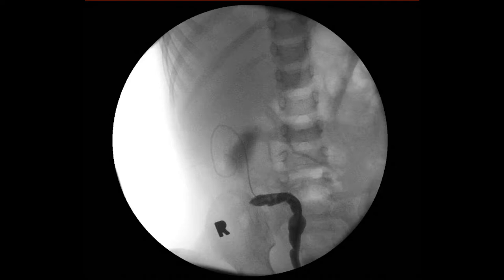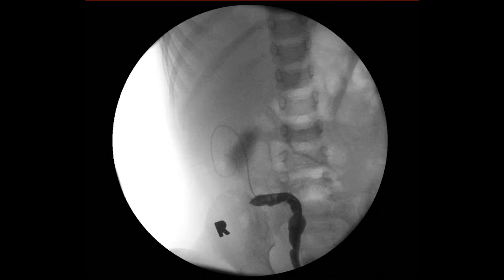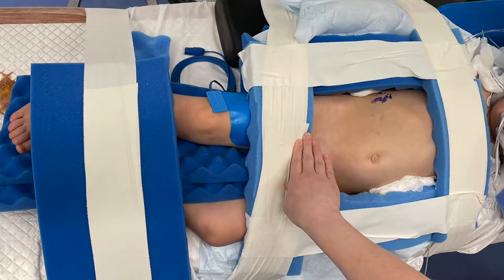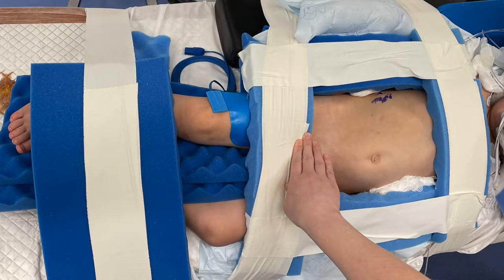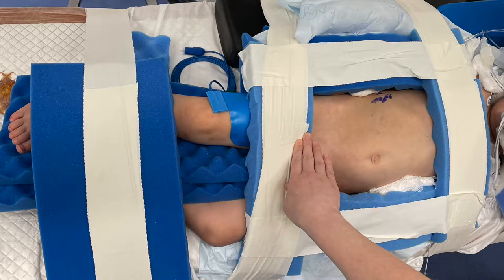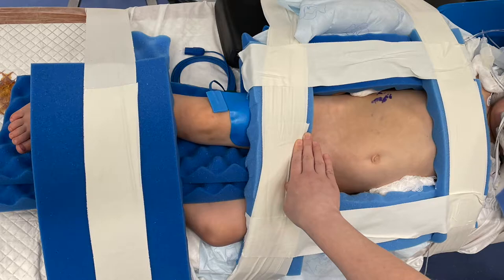I want to point out that that kind of cobblestone appearance of the distal and mid-ureter is just a result of very long-term indwelling stent use. This is the typical position I use for a young patient during a robotic procedure in the flank.